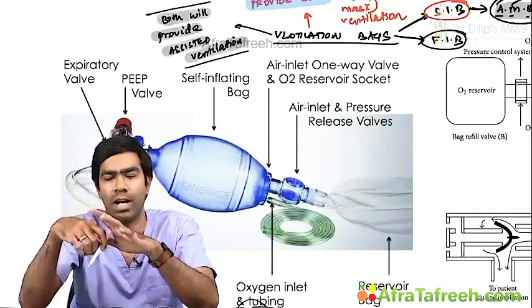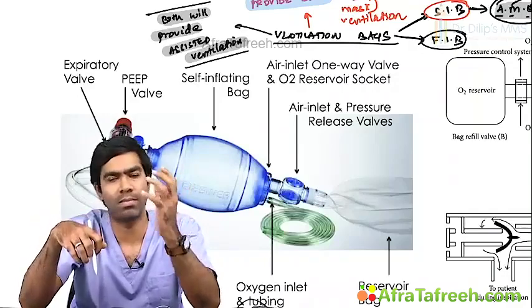So when you press these bags, the re-expansion depends on the gas flow. In ambu, whether the gas flows or not doesn't matter. It will reinflate automatically if it's connected to the atmosphere. But this flow inflation bag, after you compress, will re-expand only if there is sufficient oxygen flow. Otherwise, it will not inflate. At the same time, it should not have any leak outside. If the flow comes in and leaks out, it will not inflate automatically.